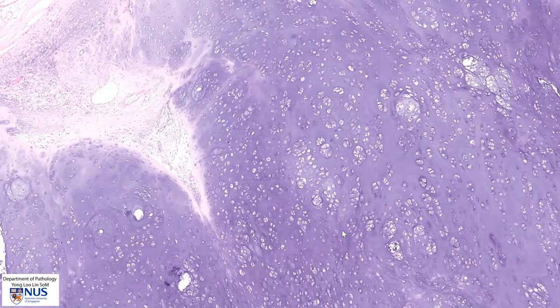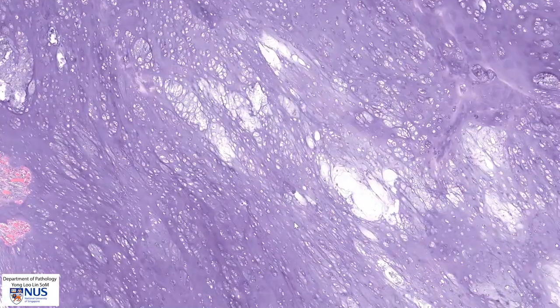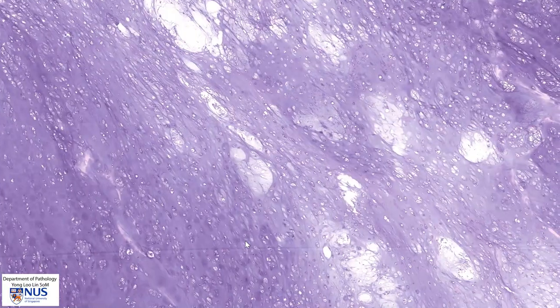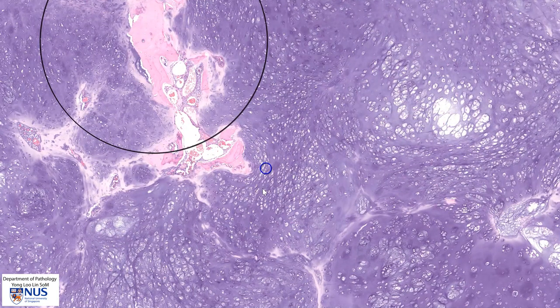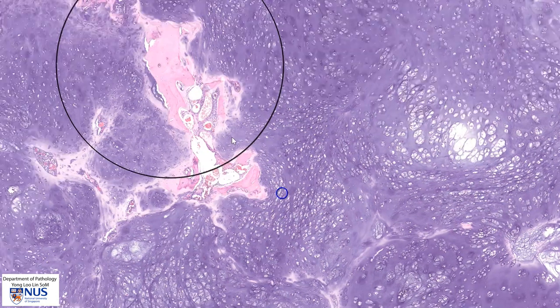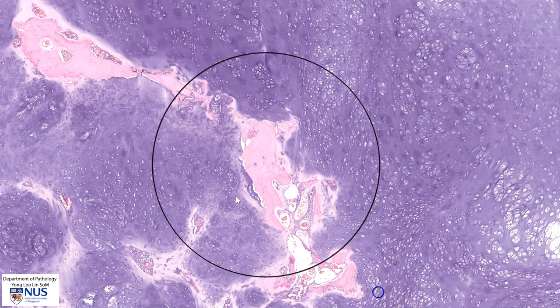The cellularity is quite variable. We can see that in some areas the cellularity is not so high, for example here, and in other areas the cellularity is higher, for example here. Over in this region we can see that this cartilage tumor almost surrounds this little island of bone, and this kind of growth pattern is an indication of malignancy and it is known as permeation of the bone.